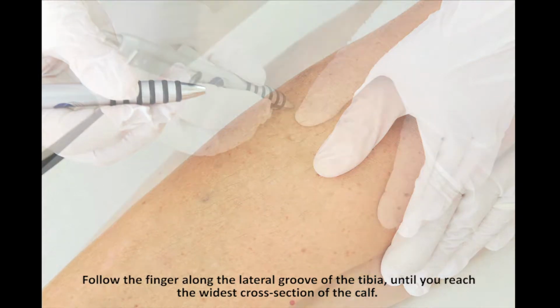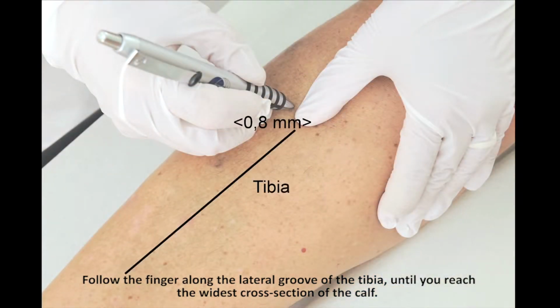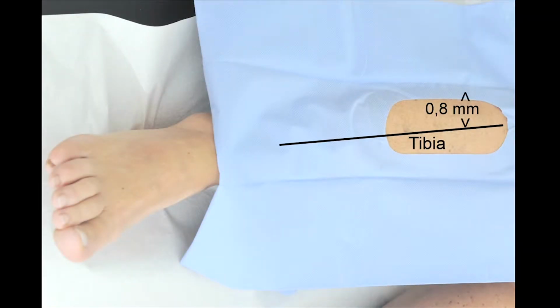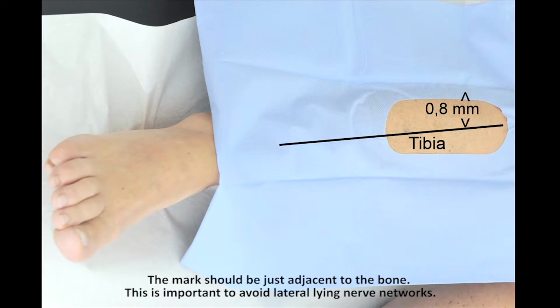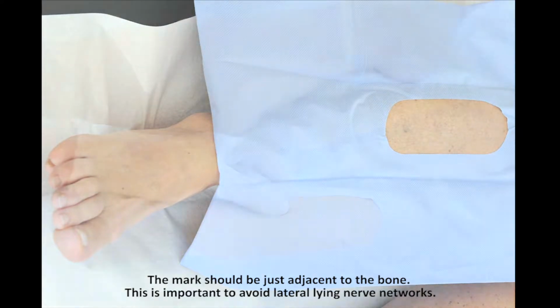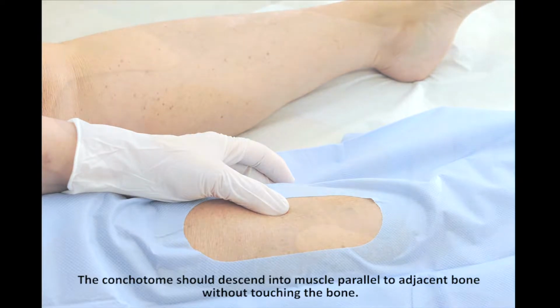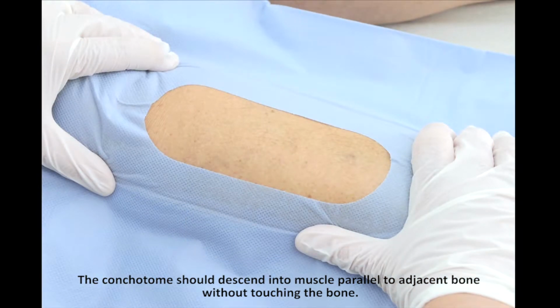follow the finger along the lateral groove of the tibia until reaching the widest cross-section of the calf. The mark should be just adjacent to the bone. This is important to avoid laterally lying nerve networks. The conchotome should descend into muscle parallel to the adjacent bone without touching the bone.